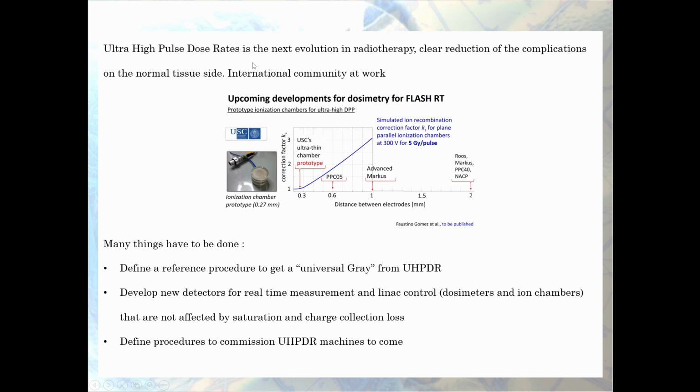So people are working on that. To me, clearly, it will be the next evolution in radiotherapy, because there is a clear reduction of the complications on the normal tissue side. Okay. Many people are working on it all over the planet. It looks very promising, and some people, an Italian team, if I'm not mistaken, have designed a small ionization chamber with a small gap between electrodes.